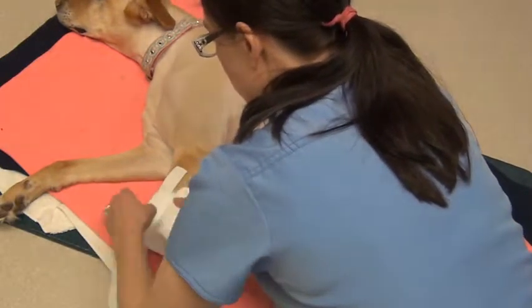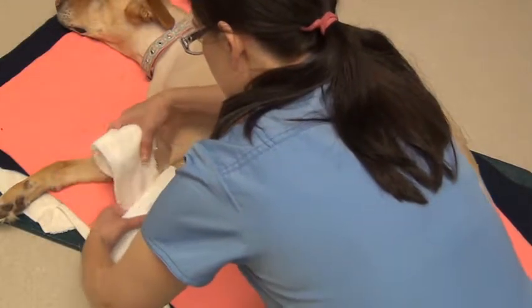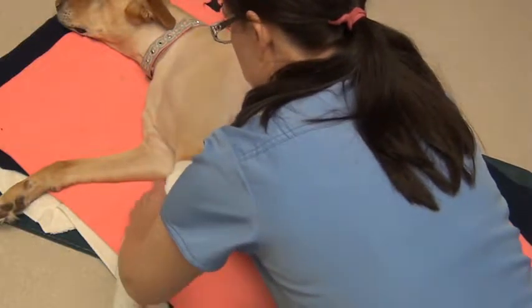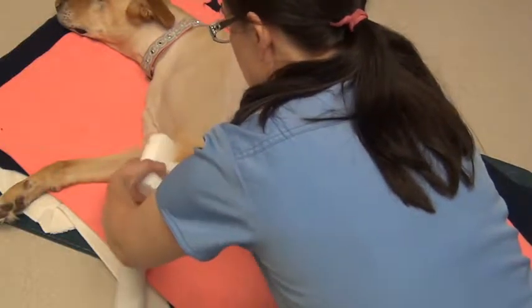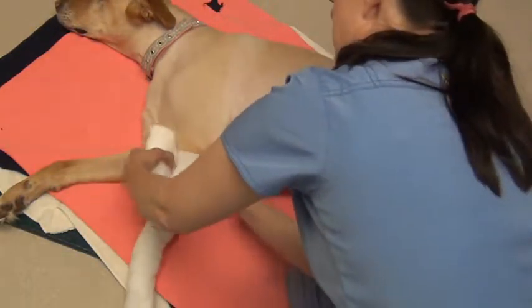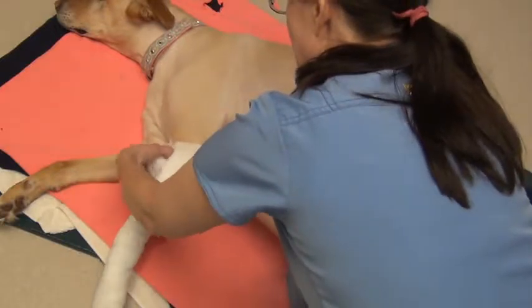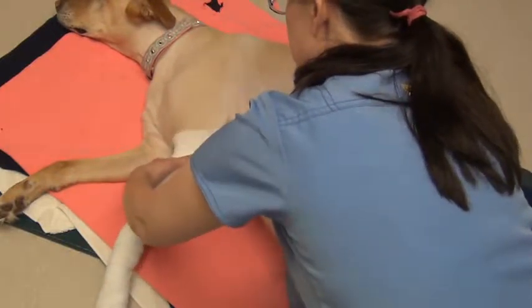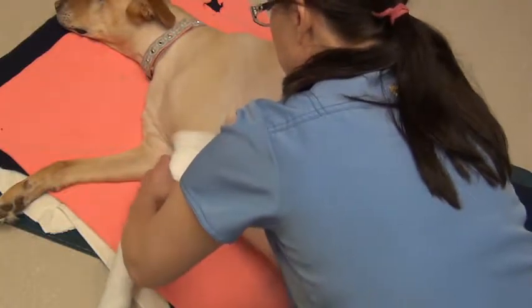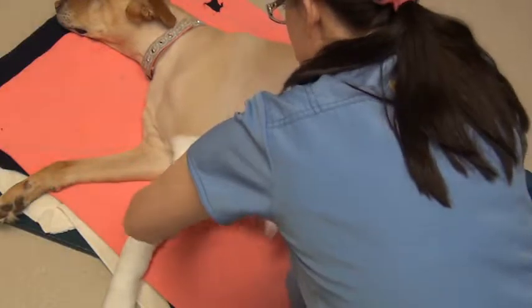And I'm going to pad this extra well because I'm using that metal splint. I don't want to cause any chafing. I'd much rather have a plastic one, but we did not have access. Alright, when I'm doing my roll gauze, my cotton cast padding, I'm going to go pretty high up into our axillary region to give some padding up there in case our splint comes up that high. We've got to be careful and make sure we pad that. I'm probably going to put an extra layer on. I'm going to tear here.